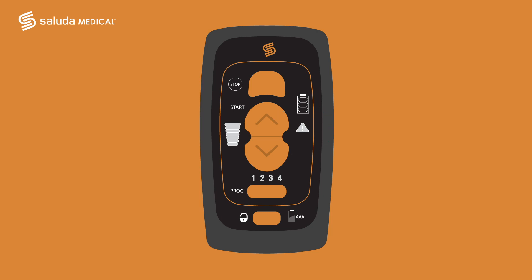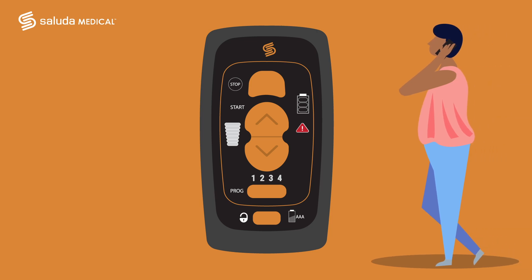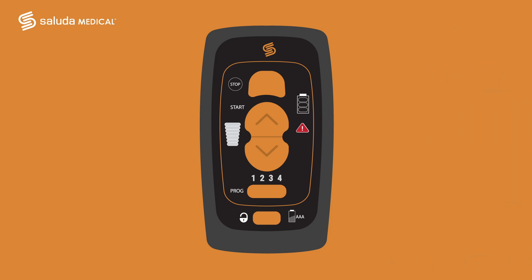Next, let's look at the triangle symbol with the exclamation mark on the middle right of your remote. This button is the contact clinician indicator. The symbol will light up when the system has detected a problem. If you notice this, you should call your Saluter representative or contact your clinician for assessment. This icon will not light up if the remote is off.